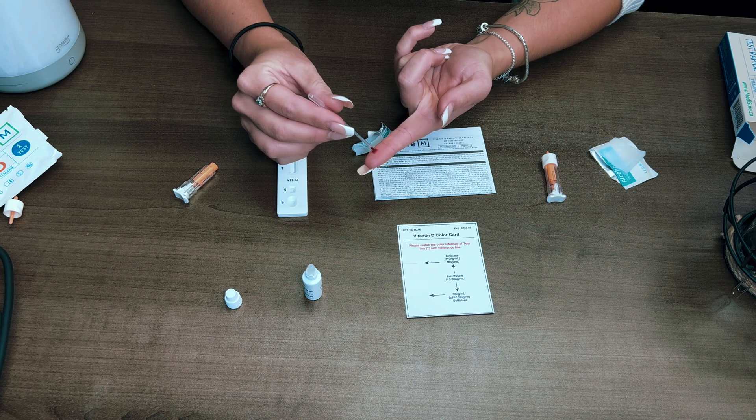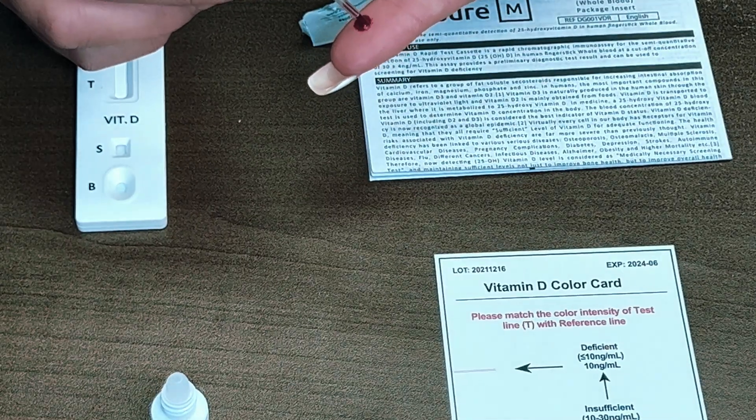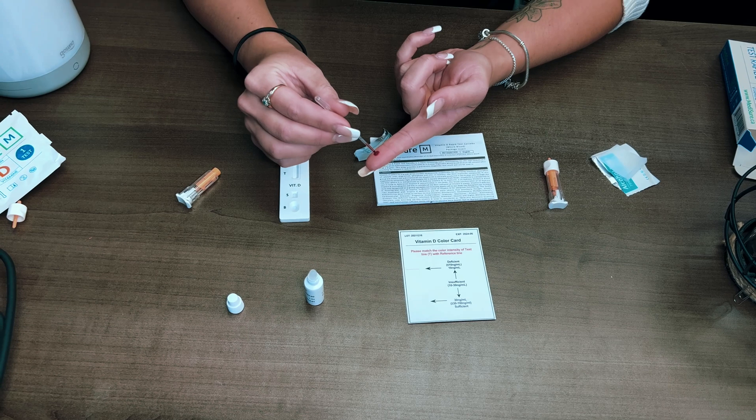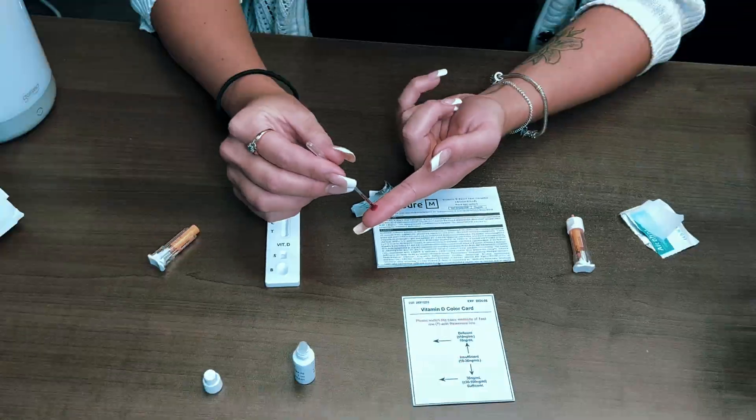Next, grab the capillary dropper. What's important here is that once you have it in your hand, you just tap it on the blood — do not squeeze it to suck the blood up. Just tap it on the area with the blood, keep tapping it patiently until it fills up to the recommended line.